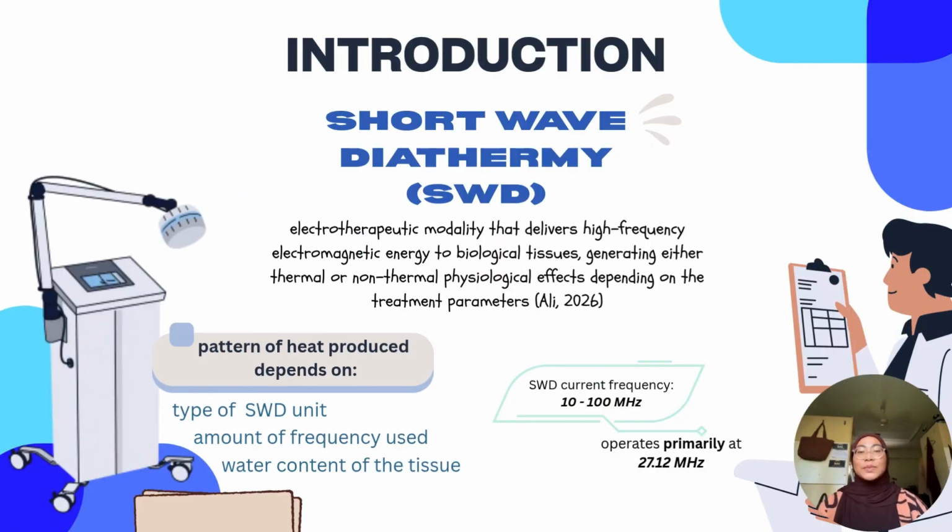So just now, I explained to you about medical diathermy generally, but for our presentation, we specify in shortwave diathermy, SWD. So what is SWD? It is an electrotherapeutic modality that delivers high-frequency electromagnetic energy to biological tissues, generating either thermal or non-thermal physiological effects depending on the treatment parameters.